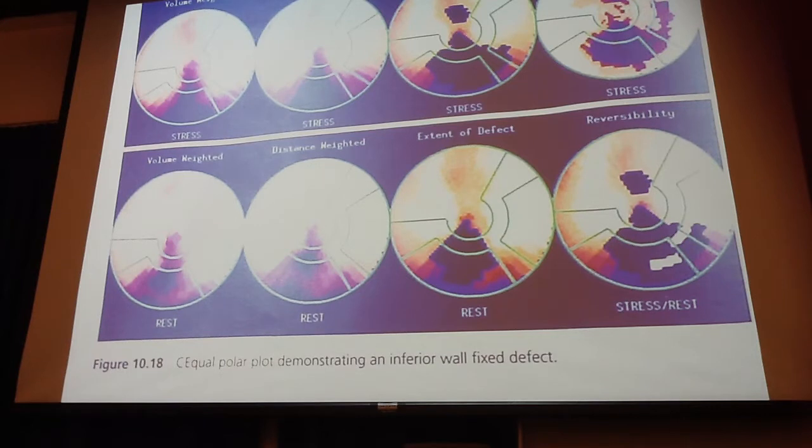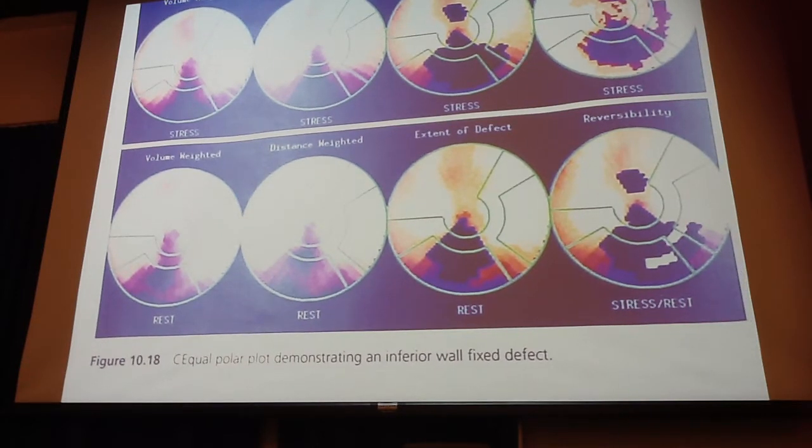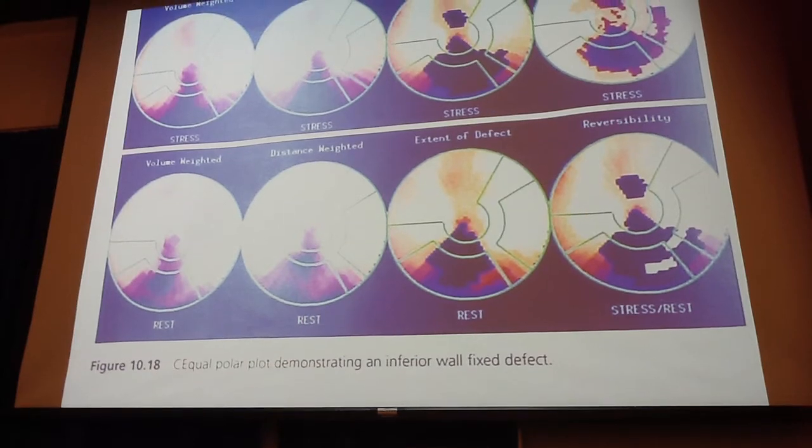Negative. It's a negative infarct imaging agent. If you're using thallium or any of your perfusion imaging agents, that's going to produce a negative.